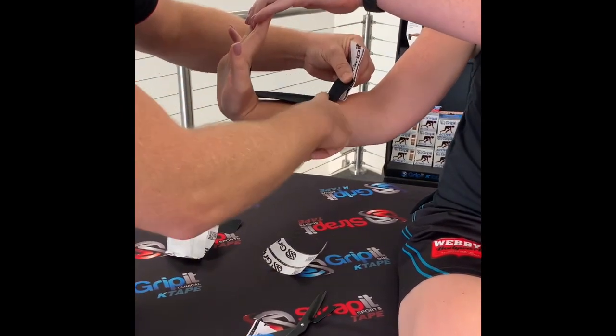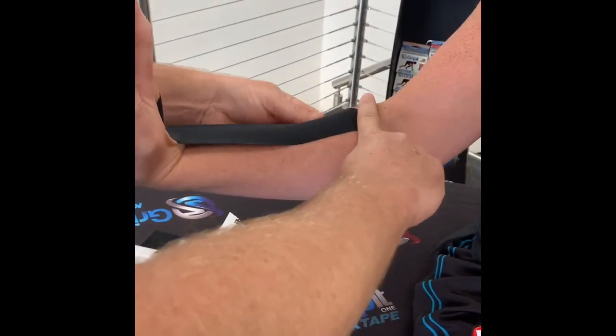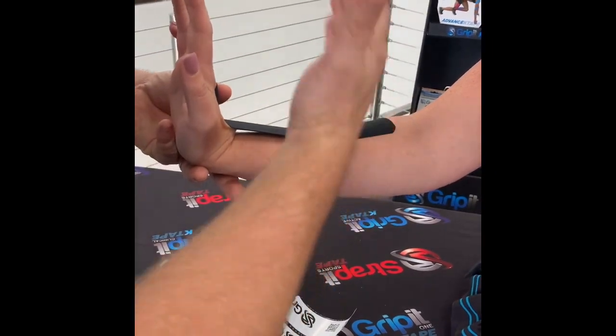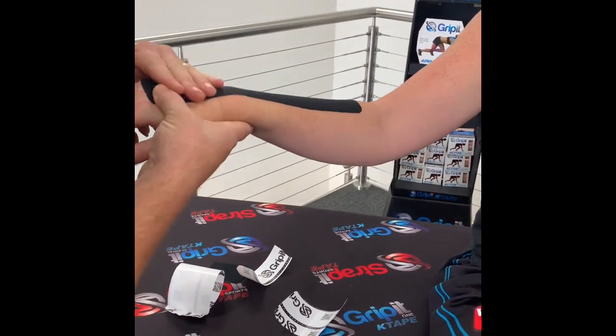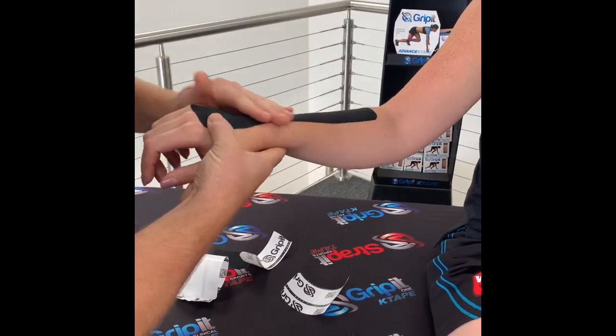And watch here, come in close. Watch the application of the anchor. No tension. Must have a long anchor, not a little one. And in this position here, because the tape's got such good stick and stretch, Amy can just flex forward, yep, and then as she does that, perfect. We can just massage that in so there's no skin creases. And we have 2 good-sized anchors.